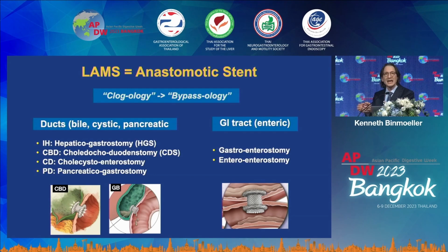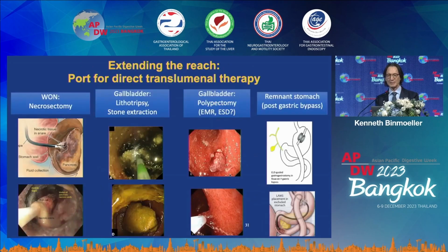The surgeons have dominated the bypass terrain, but now we can create bypasses, and we can create the bypass with ducts, the bile duct, the pancreatic duct, the cystic duct. So these are all variations of how we can bypass the biliary pancreatic system. And the GI tract, you heard from Takao how we perform gastroenterostomy and enterostomy.